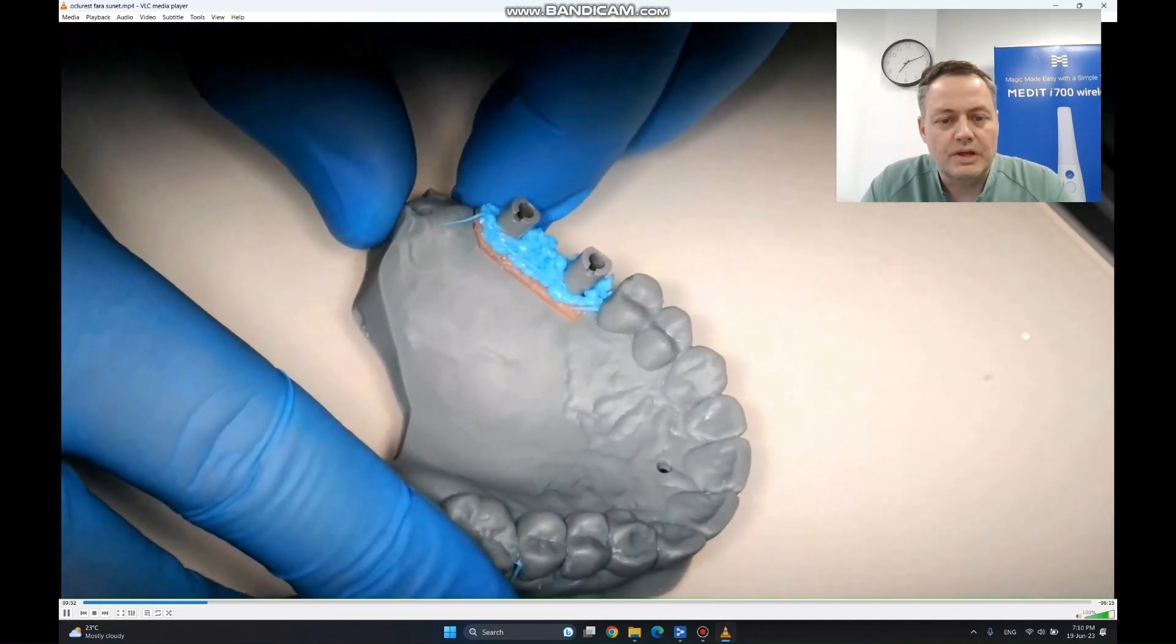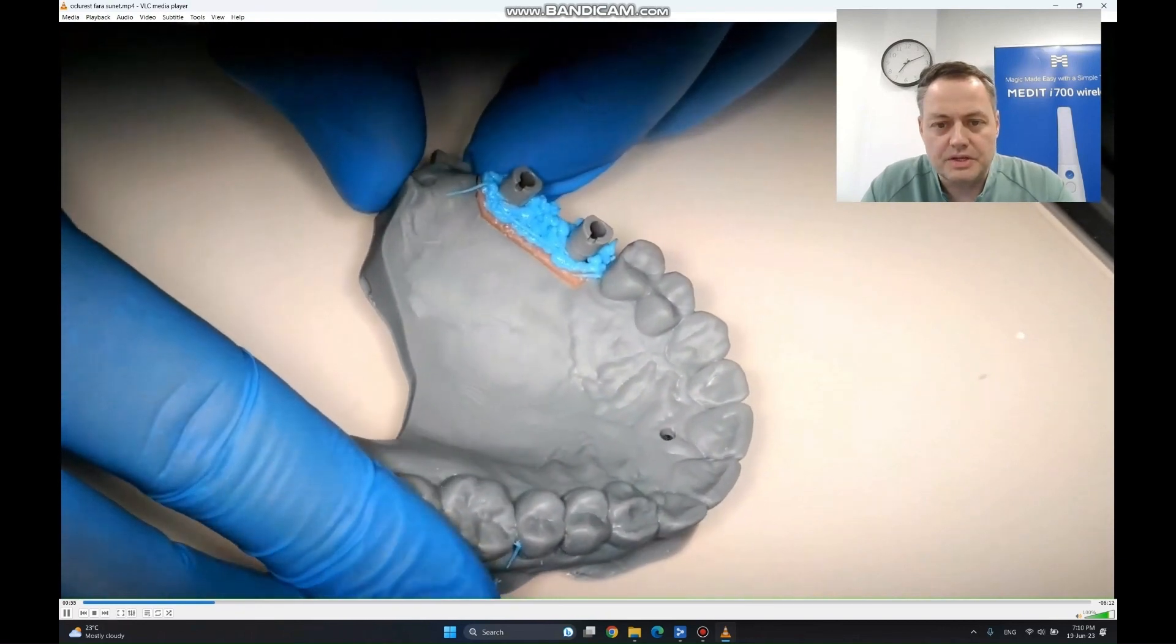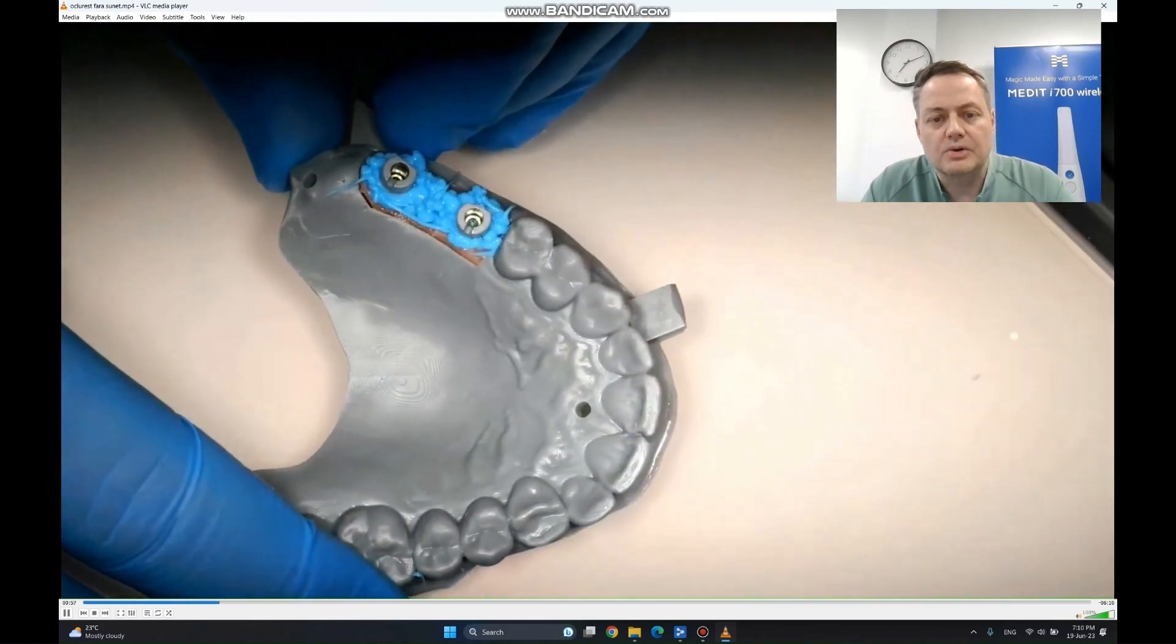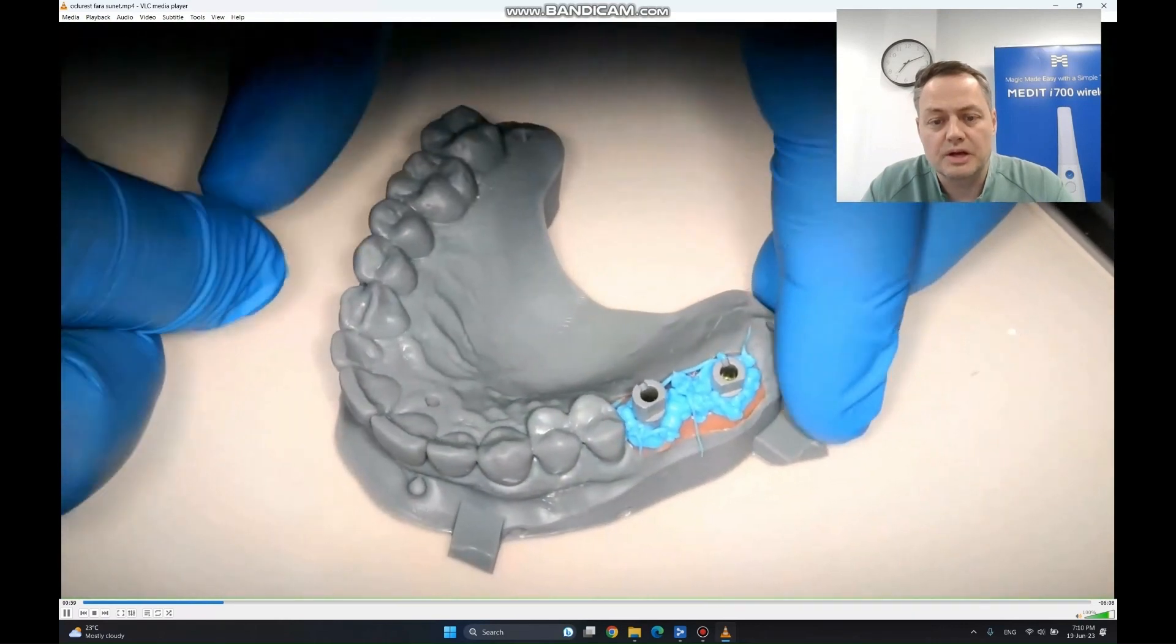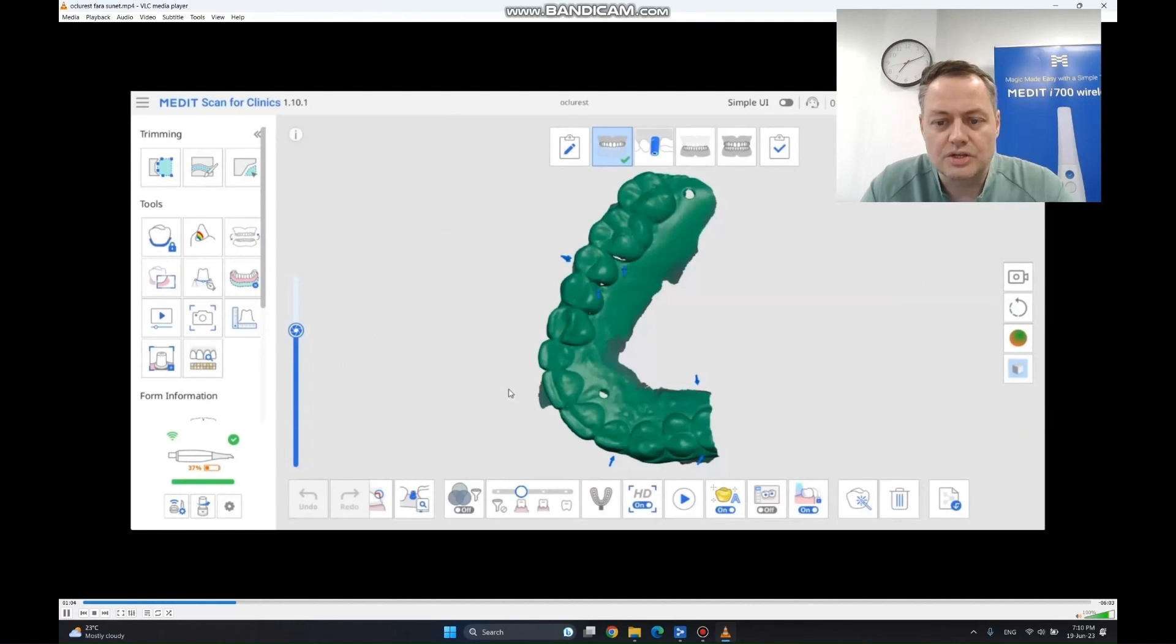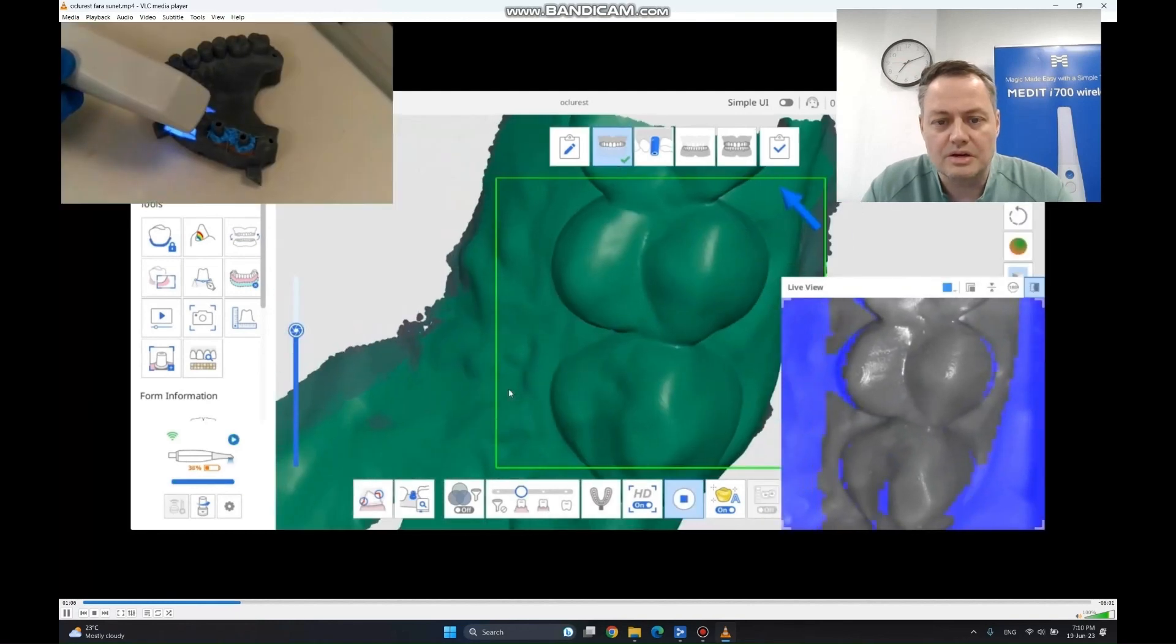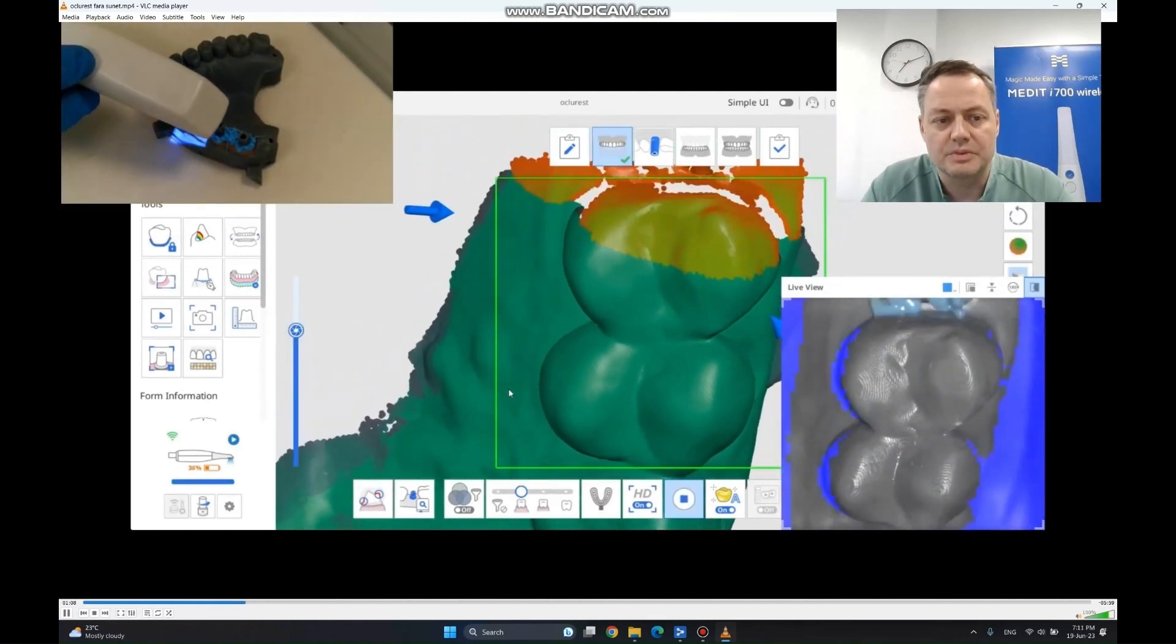We leave the material to set. If you use it in the lower jaw or even in the upper jaw, you have to control the soft tissues around it and also the tongue, so that it doesn't get in the way and deform this material.